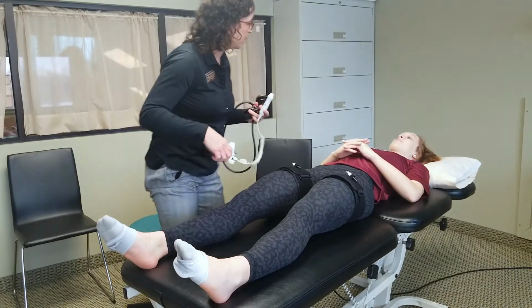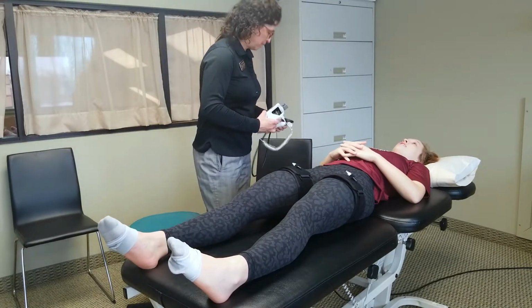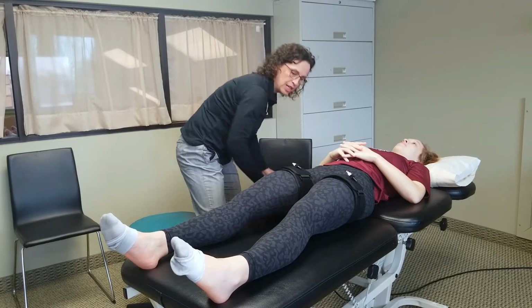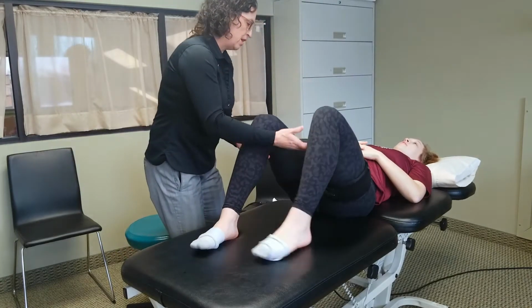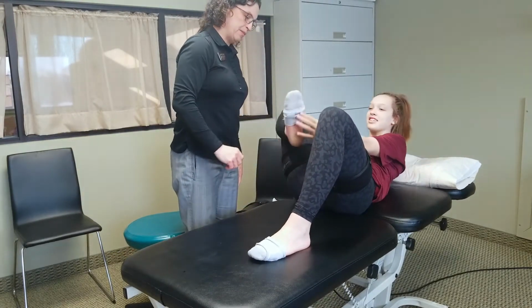Rachel, what's it feel like right now? Just pressure, there isn't really any pain. Not any pain. Okay, good. Bend your knees. Good. And then you're going to lift your hips 30 times for me. Yeah, you can pull your socks back on.